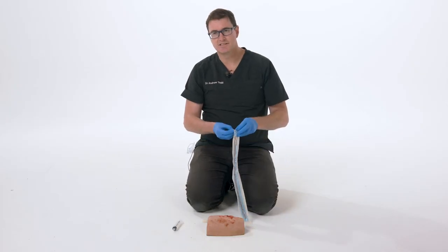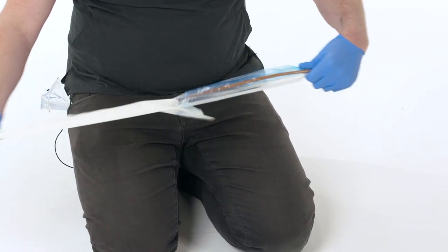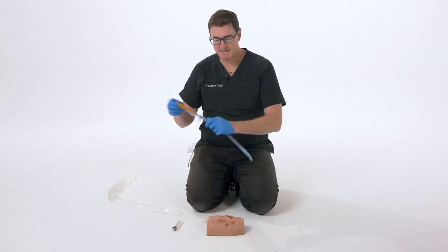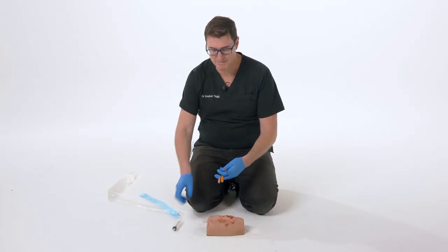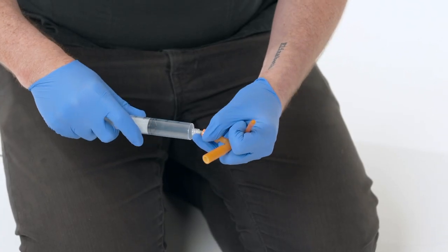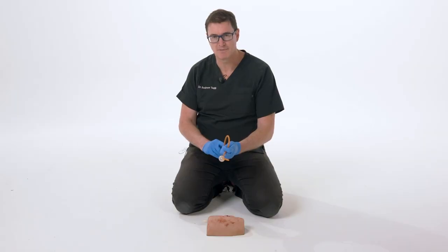We're going to use a different technique using a sterile Foley catheter. I've got a standard 18 French Foley catheter. The balloon can be inflated with up to 100 mils before it pops, so just 20 mils is enough to cause local tamponade of bleeding vessels.